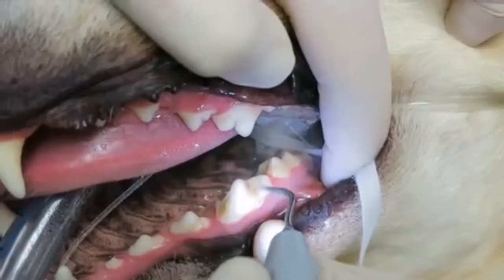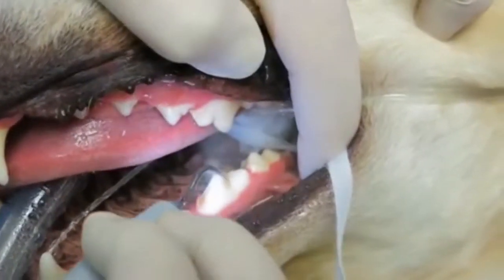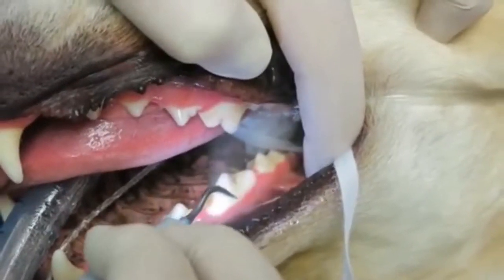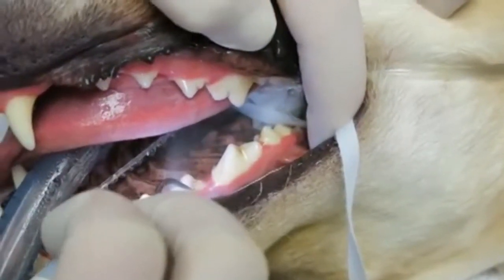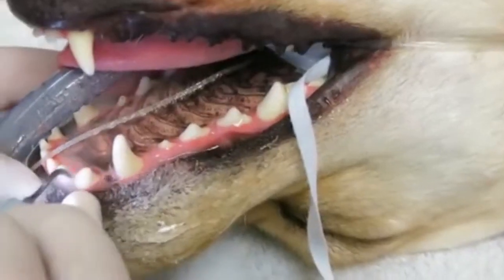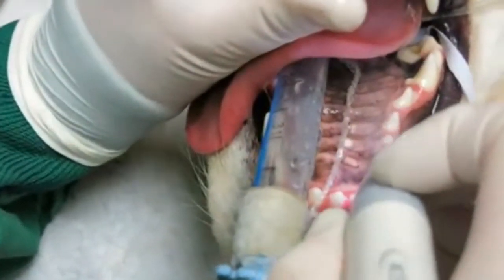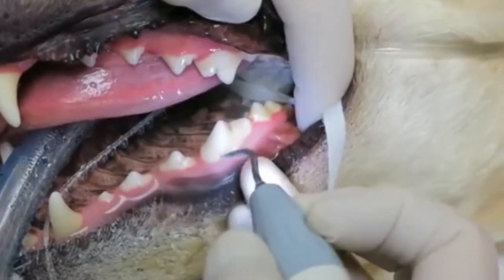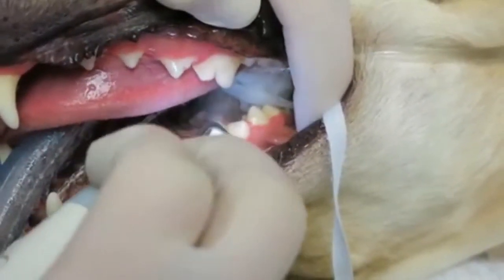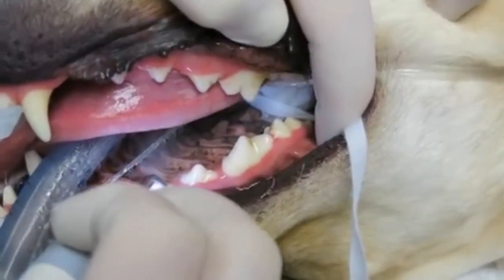This video demonstrates both supragingival and subgingival dental scaling. You don't want to be on each tooth for too long — you don't want to heat it up — but there's cold water coming out and cooling down the tooth and the instrument. Removing all of the calculus. These are quite clean because the owner is doing a wonderful job. There's not a lot of tartar — most dogs I'm doing have way more. This is an ultrasonic scaler removing all of the tartar from the tooth. I'm doing it above the gum line right now — I'll come back later and do underneath the gum line.